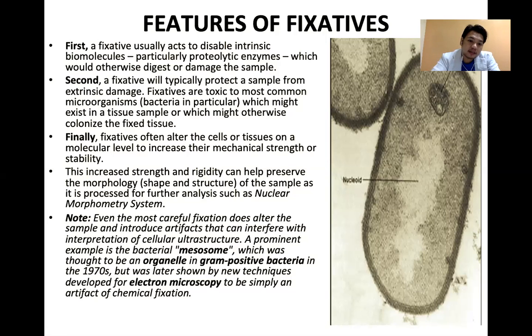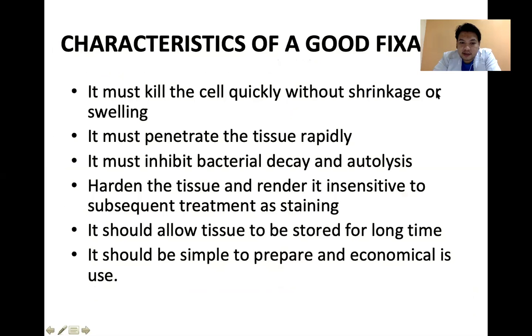So as we developed electron microscopy, we have already abandoned that theory. This organelle is actually classed as an artifact of chemical fixation. So this happened because the organelle appeared as an artifact after chemical fixation.